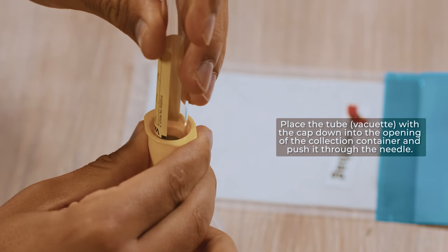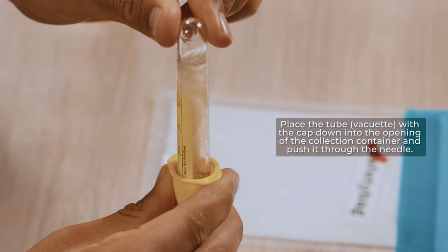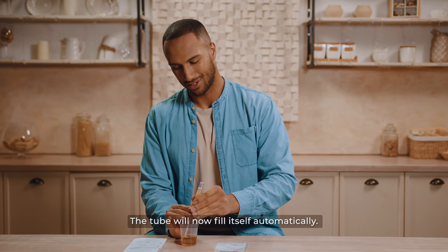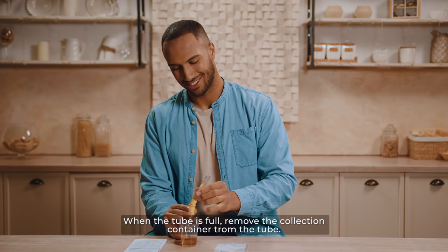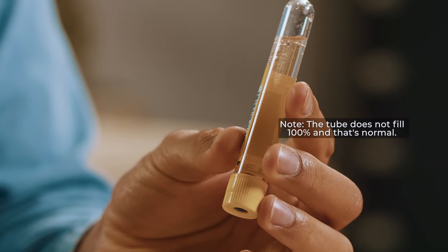Place the tube (vacuette) with the cap down into the opening of the collection container and push it through the needle. The tube will now fill itself automatically. When the tube is full, remove the collection container from the tube. Note: the tube does not fill 100%, and that's normal.